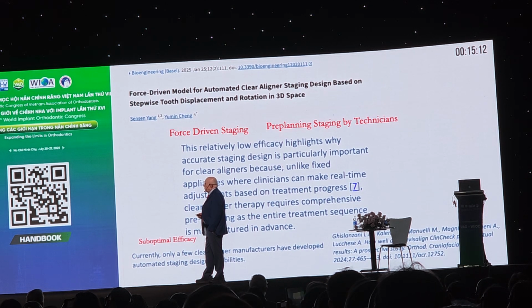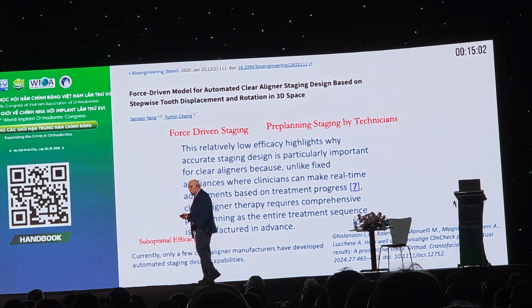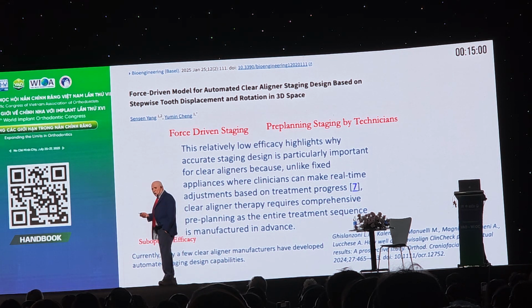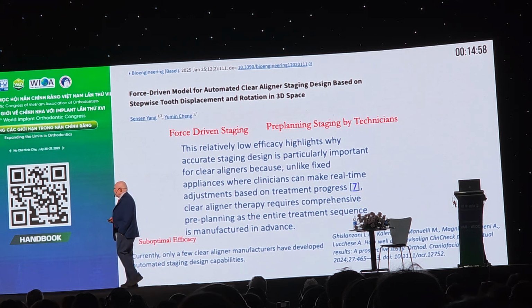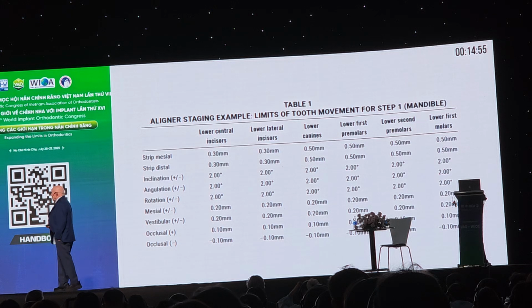If you get a chance, please read this paper, Bioengineering, "Force-driven model for automated clear aligner staging design based on stepwise displacement and rotation." It tells you exactly how the teeth should be moved. Very, very good paper for us.